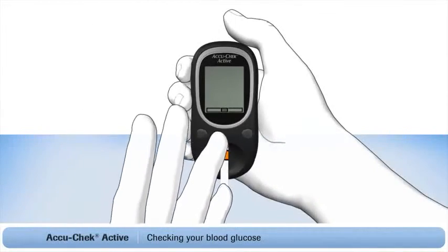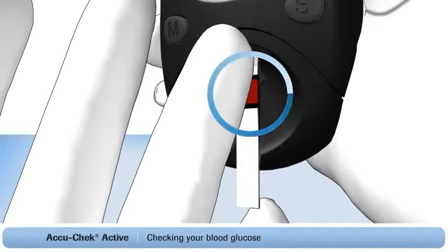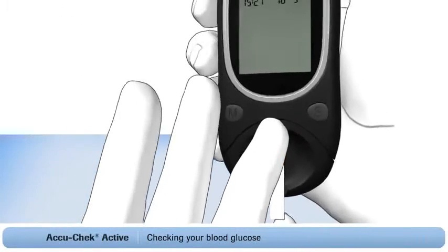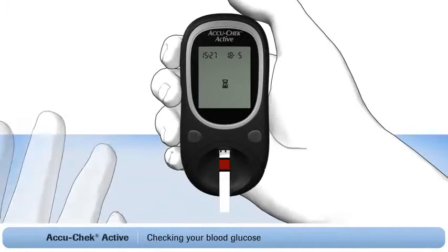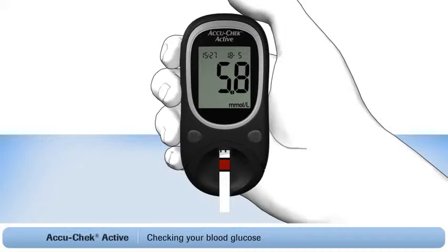Apply the blood to the centre of the orange test area on the strip. When enough blood has been applied, a small hourglass symbol will appear on screen to show you that the meter is working. Your blood glucose reading will be ready in 5 seconds. It's just that easy. Now you have your blood glucose reading.